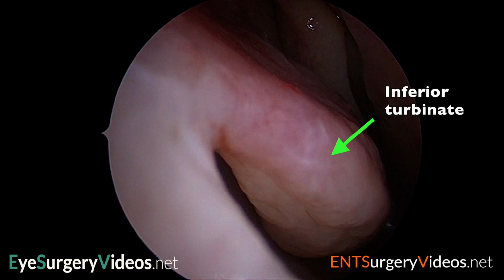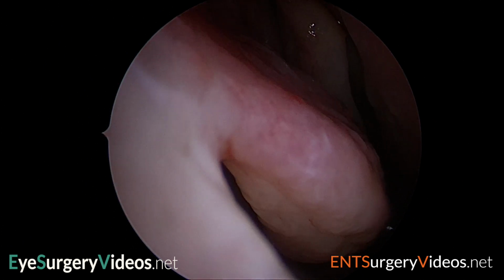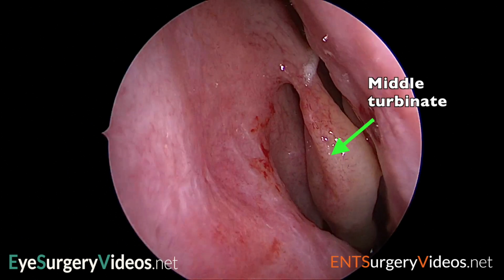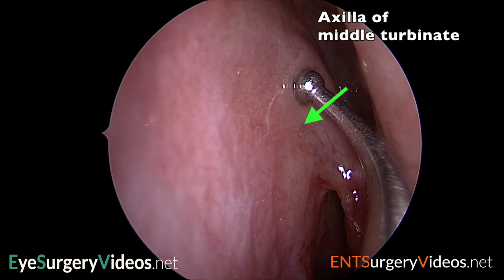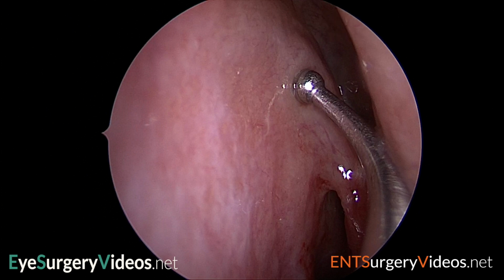The inferior and middle turbinates are seen with the endoscope. The middle turbinate inserts onto the thick bone of the frontal process of the maxilla and the frontal bone. The anterior-most line of this insertion is called the axilla. The axilla is a constant landmark and therefore used to orientate DCR surgery.